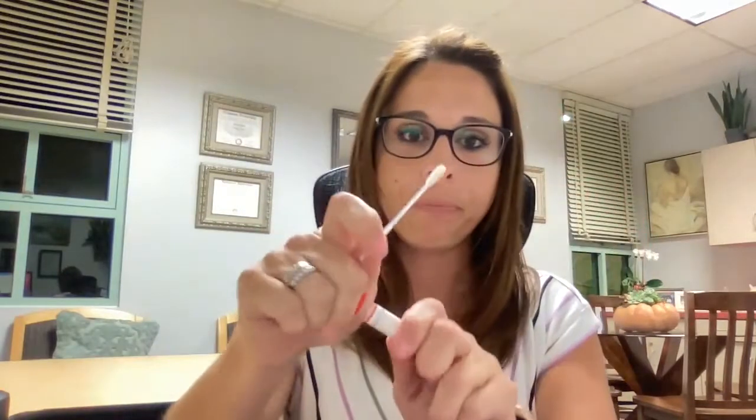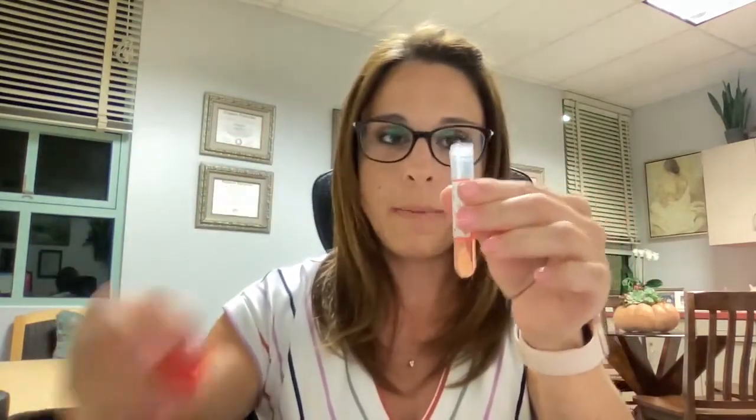I know, a little weird to watch your principal do this. It's okay — we're going to do it every week together. You have your swab, you've swirled it around about five times. Your tube will have your name on it — you open it up, plop your swab in there, close it up, and you'll hand it to the medical staff. At any point you need help, they're there to help you. You can ask them questions.